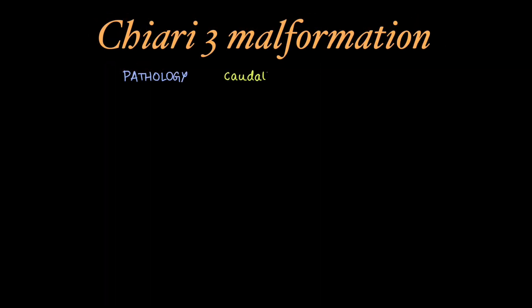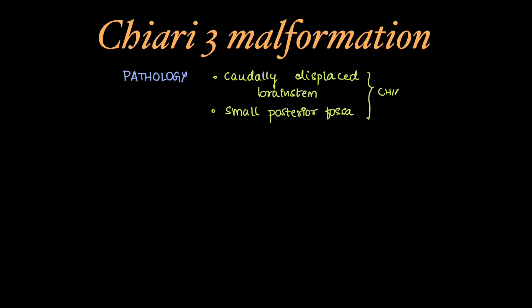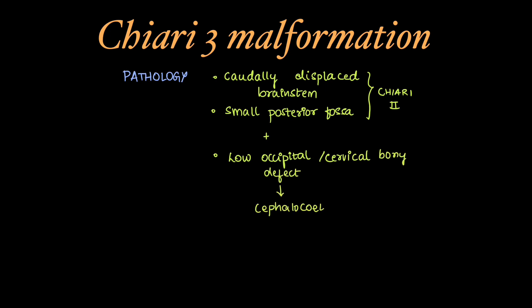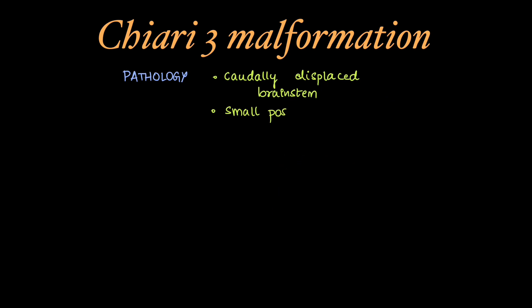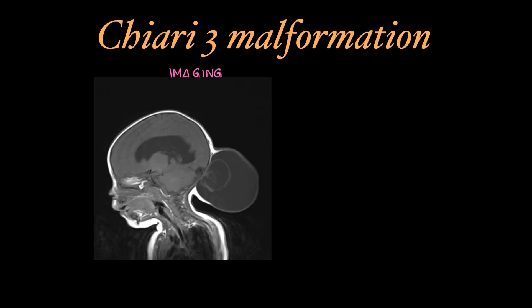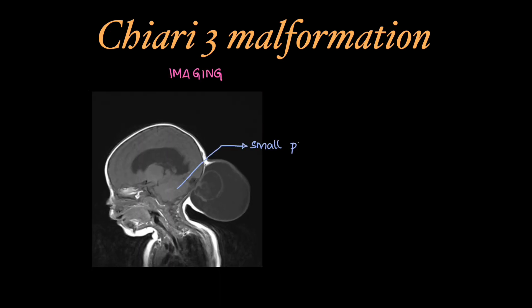In Chiari 3 malformation, there will be a caudally displaced brainstem with a small posterior fossa, just like Chiari 2 malformation. But instead of myelomeningocele, there is a low occipital or cervical bony defect leading to a cephalocele. MRI is the modality of choice, and on T1 sagittal images we can see a small posterior fossa and a cephalocele with herniated meninges.